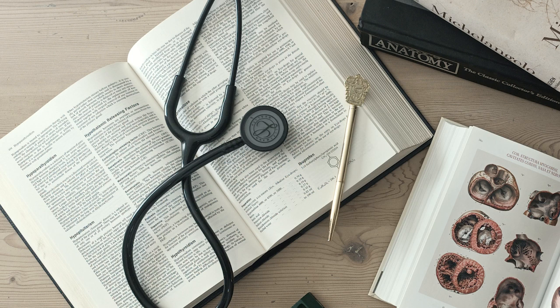This is because conduction is occurring rapidly through the AV node and down the normal ventricular conduction system, His-Purkinje, resulting in a narrow QRS, even if the atria or AV node are firing rapidly. Examples include AVNRT, AVRT, atrial tachycardia, atrial flutter with rapid conduction. Narrow QRS usually means SVT.